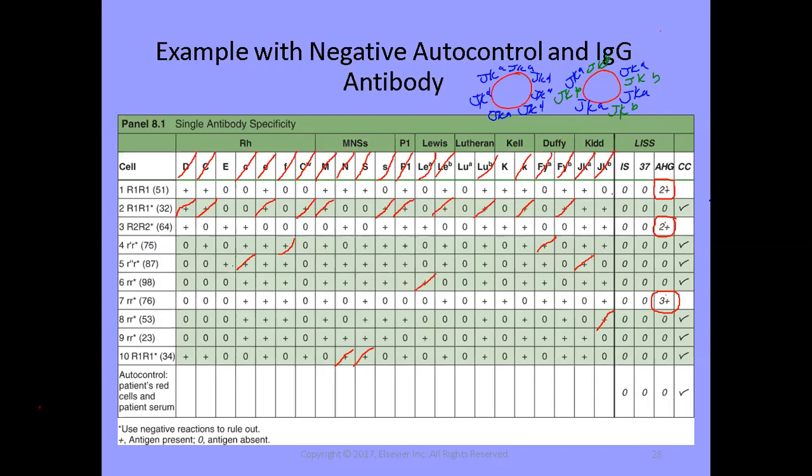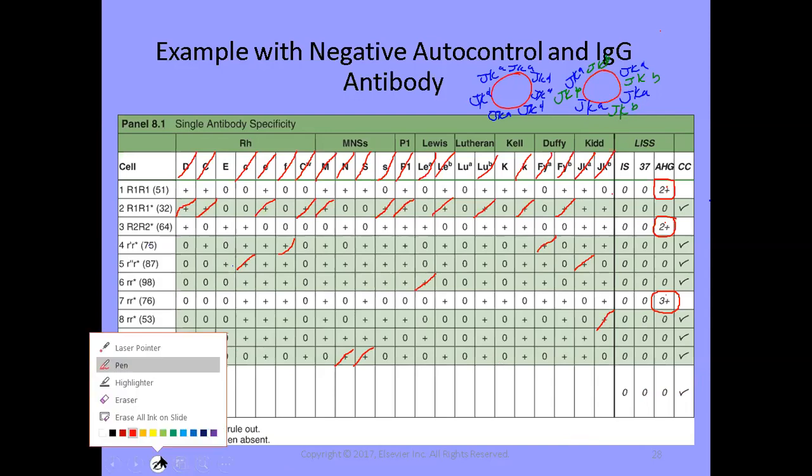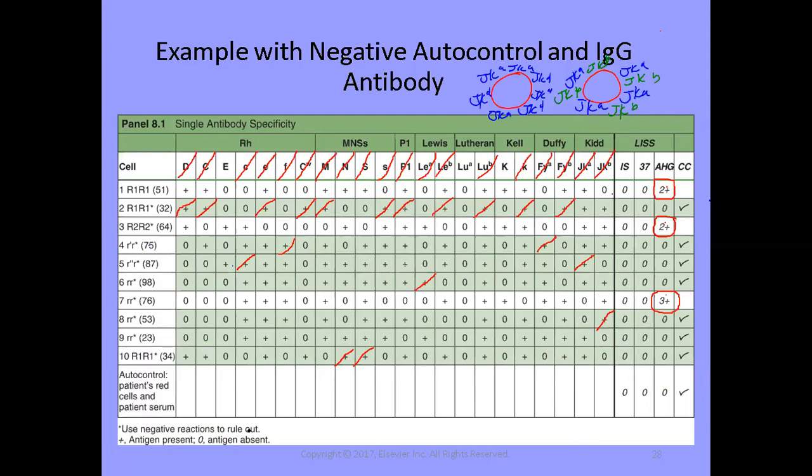But you can see how the patient tested completely negative, but that doesn't really help us for ruling out. So we have a few specificities that are left, and I want to change my pen color to something else now. Let's see. I'll go for blue. All right.